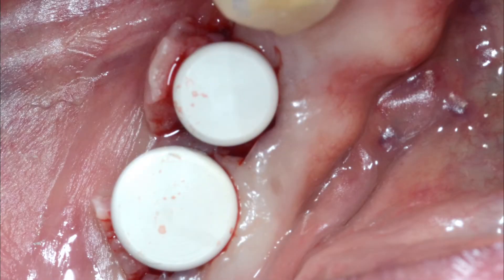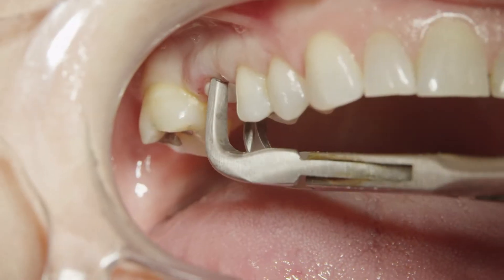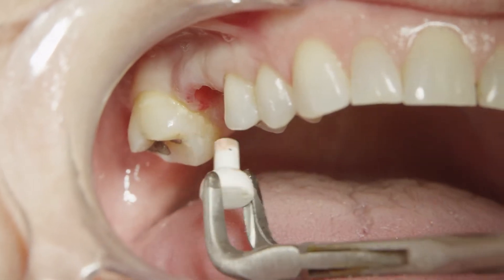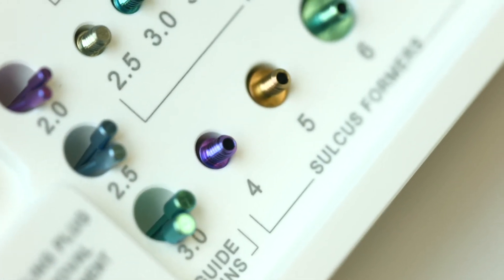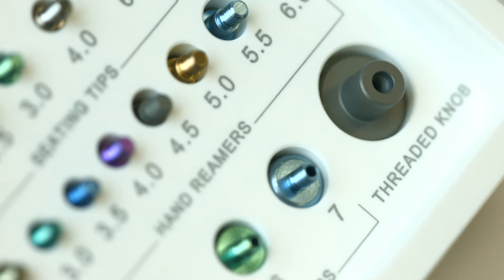The second method, after uncovering the implant, a healing or temporary abutment is inserted. After the crown fabrication by the lab, we remove the abutment that was keeping the soft tissue open and insert the crown in place. Prior to inserting the abutments, we should use the sulcus former corresponding to the abutment that we are inserting.